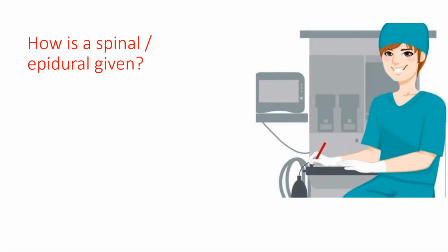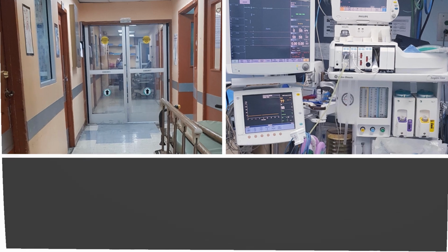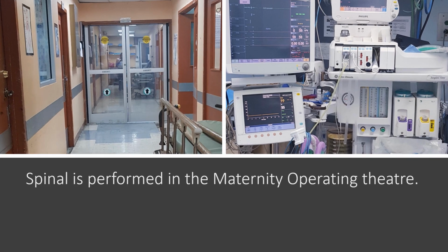So how is a spinal or epidural performed? The person performing your spinal will be an anesthesiologist who is a doctor specialized in administering anesthesia. He or she may be accompanied by another anesthesiologist and an assistant. Your spinal will be performed in the maternity operating theatre.